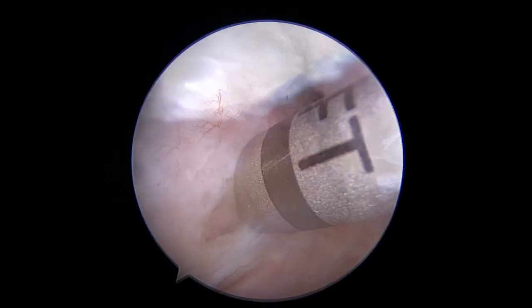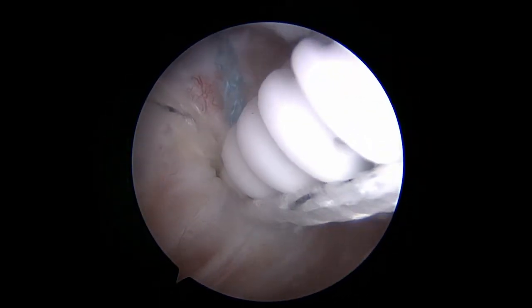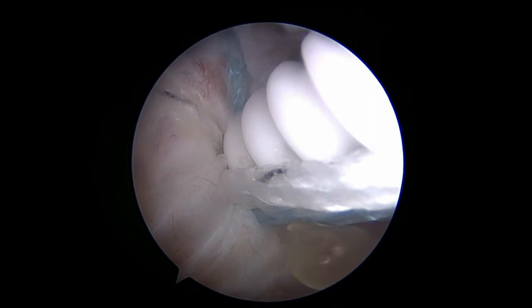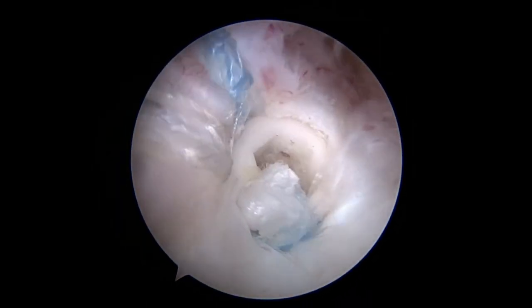The posterolateral socket is punched and the remaining fiber tapes are brought posterolateral to the final swivel lock anchor and fixed in place. This completes the speed bridge configuration on the lateral tuberosity.